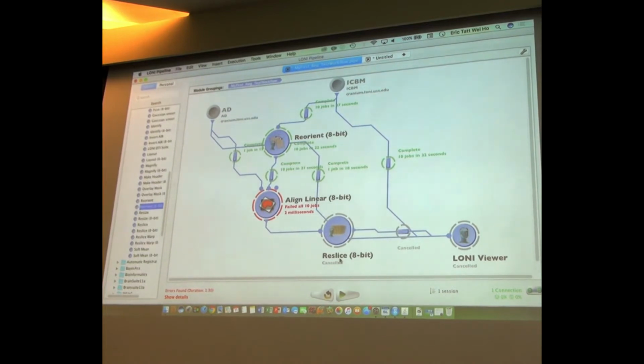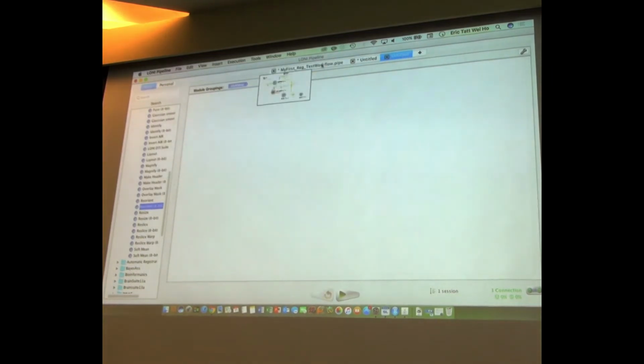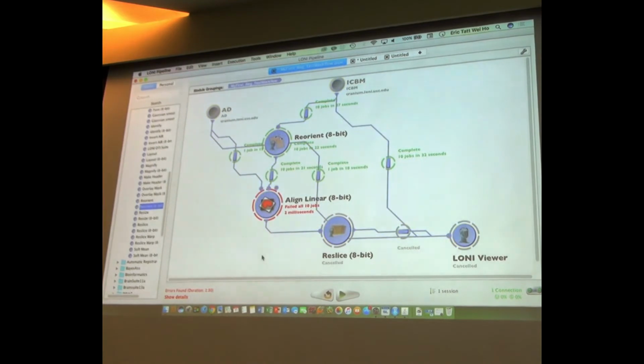Okay, let me try. Now look, you guys, sometimes you're going to get in these situations and you don't want to be recomputing the stuff that was already computed. So look at this little trick here now. I'm going to select all of them, copy them, open yet another new workflow. Actually, step back. Just select the bottom 3 of these guys. Just select the remaining modules that failed execution. I don't have to redo the previous modules.